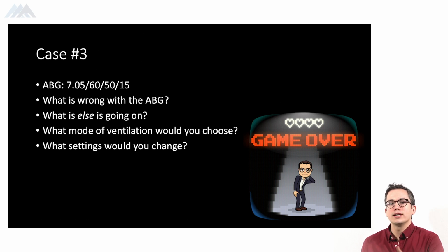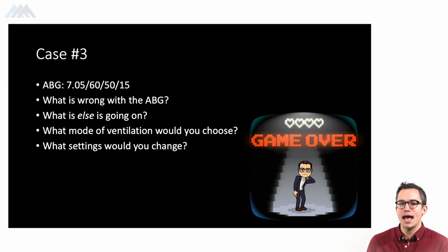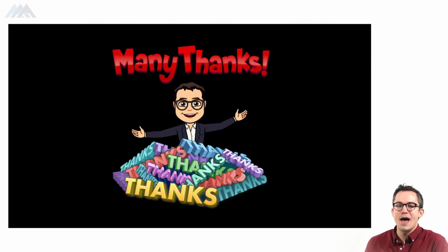After some time, we're going to draw another ABG and see how those initial settings work and continue to tweak those based on what that end result is. I know that that was a ton of information for you. Feel free to rewind this video, rewatch this video, and practice this and take this to the bedside.